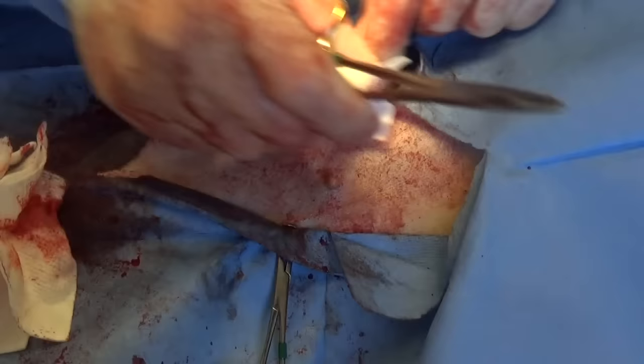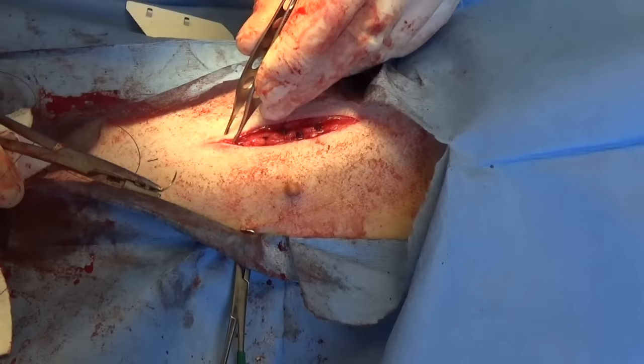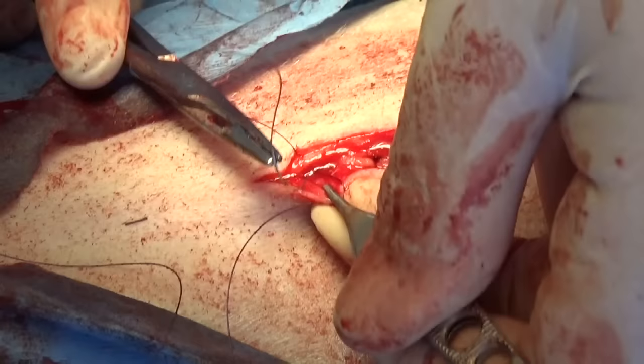So we're gonna do that again and again. And you can see where this would hold the muscles together too. It would hold the muscles together, and it holds the skin together. So I'm bringing up the edge of the skin a few millimeters away from the other one. See, I put it up. Now this one I didn't put down through the body yet. I'm gonna do that every other one or every third one. And then I'm gonna put it in the skin again.